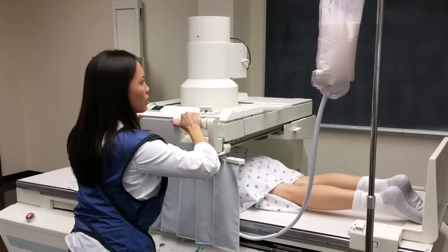A compression paddle may also be used to separate loops of bowel. Overhead images are taken by the technologist after the fluoroscopic portion of the study is completed. These overheads help piece together the spot images and provide the overall big picture of the examination with minimized magnification. Double contrast barium enema overhead protocols will vary by facility. A few of these overheads can't be replicated during the fluoroscopic exam, such as the left and right lateral decubitus images and the prone 30-degree caudal angle projection of the rectosigmoid junction. A radiologist should be ready to view these images before the patient is allowed to evacuate the barium, in case further fluoroscopy or overheads are needed. The ideal study should demonstrate each segment of the colon in double contrast in at least two different positions.